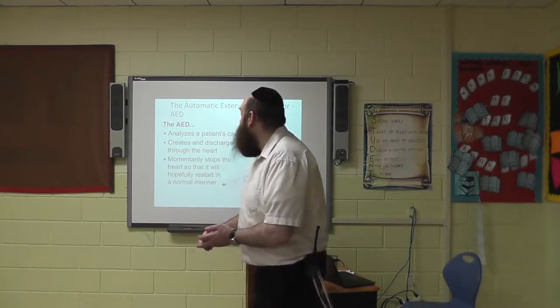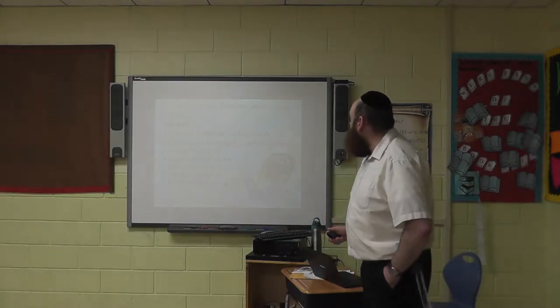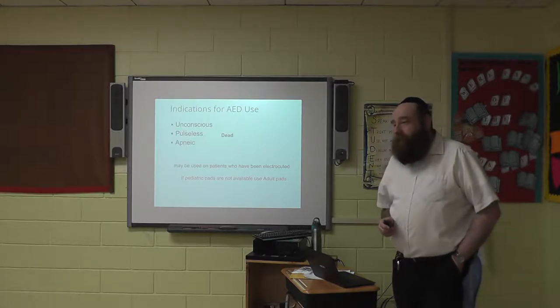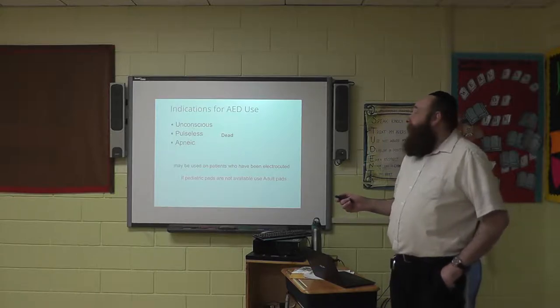Stop the quivering, all right? So that's what's going on. It momentarily stops the heart, and hopefully it'll start up again in sinus rhythm. It's like restarting a computer. Yes, very similar. It's always the same. And the risks are the same too.